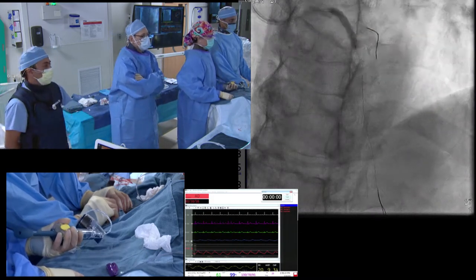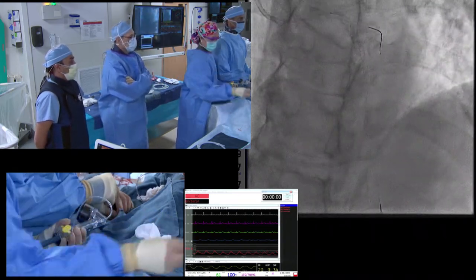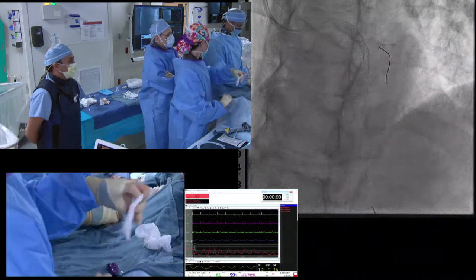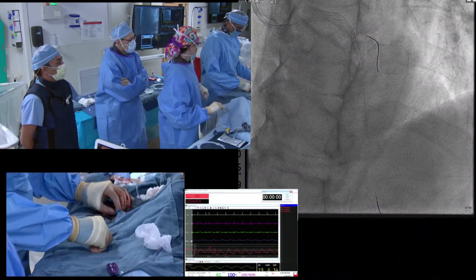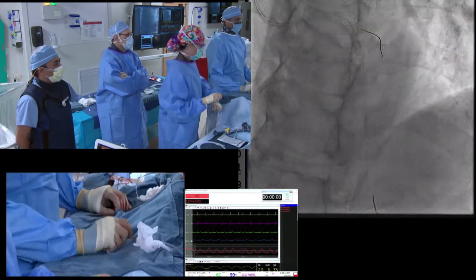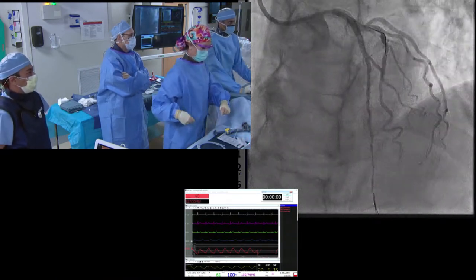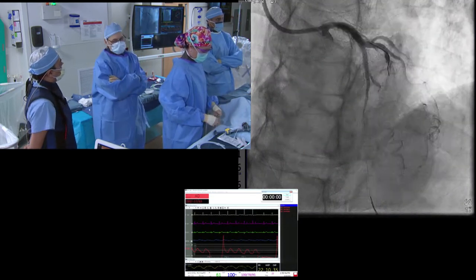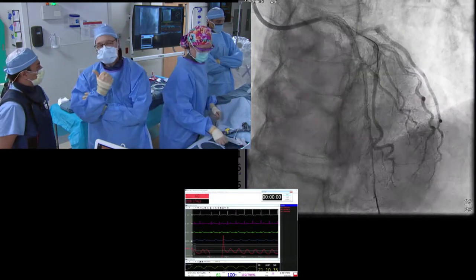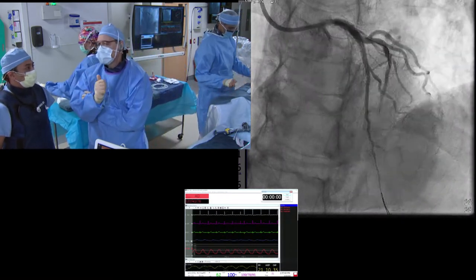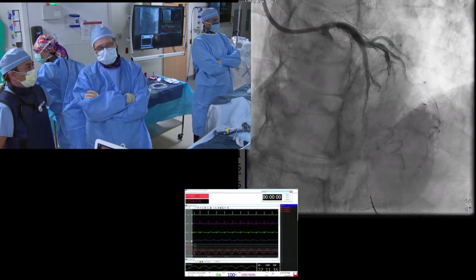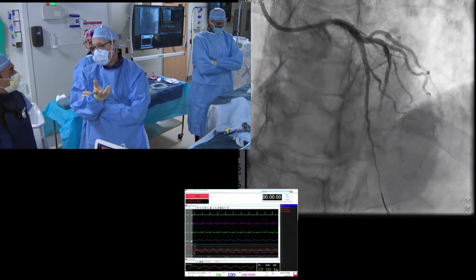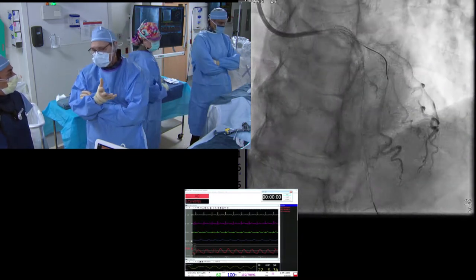Bimal, looking at this angiographically, should we still go with a 4.0? I tend to trust what my imaging tells me. Let's take a picture and make sure we've got flow down the main branch and all side branches. You can always undo something you went a little less on — if you over-dilate you can't take that back. We still have the OCT catheter on deck, so use a 3.5 at high pressure, re-image, see what expansion is. If under-expanded by more than 10%, go more aggressive.